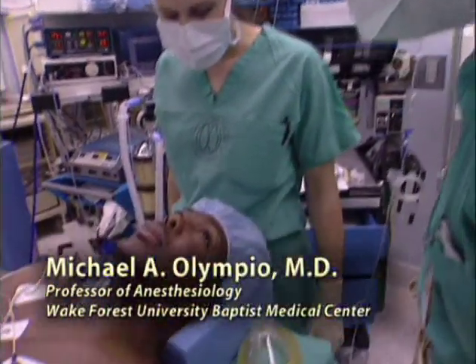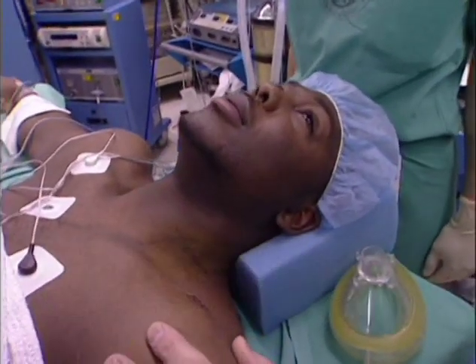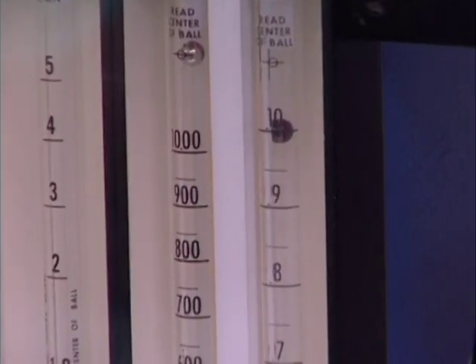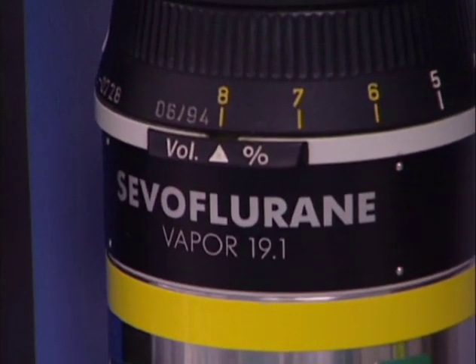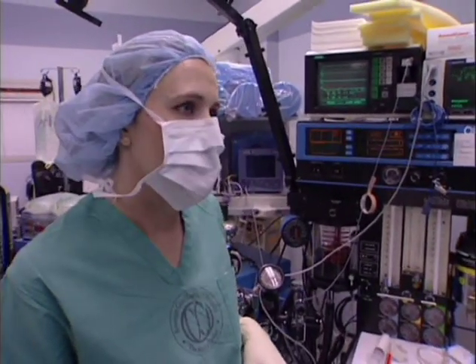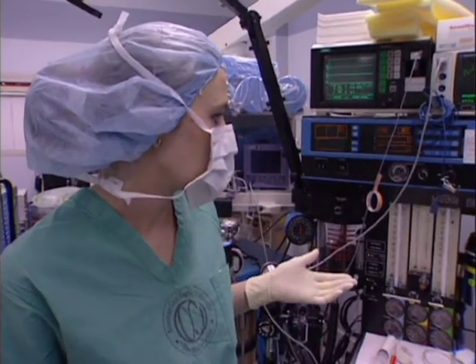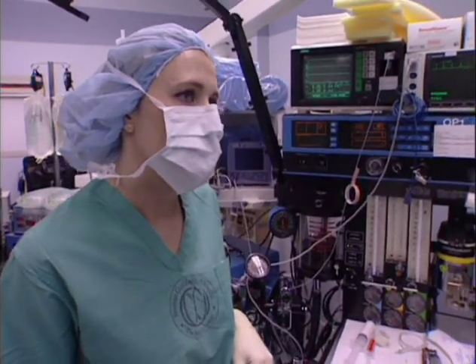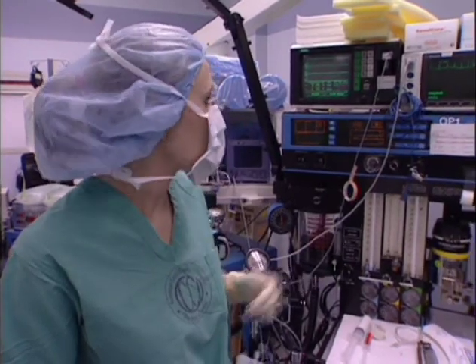We've had to prepare you for that breathing exercise? Yes. Jennifer, what have you done back here? Basically, we've primed the circuit. We have high-flow oxygen on, and we also have 8% sevoflurane on. You've chosen sevoflurane? Yes. Why is that? Basically, since it's a non-pungent anesthetic, we can increase to high MAC values and cause a fast inhalation induction, unlike some of the other anesthetics.